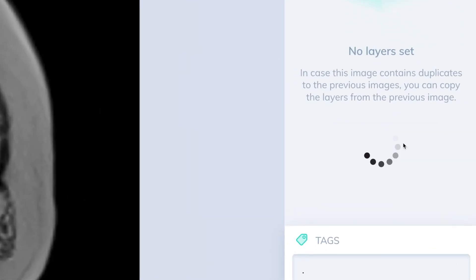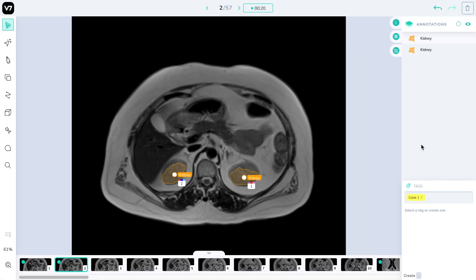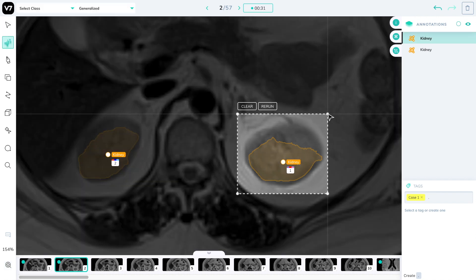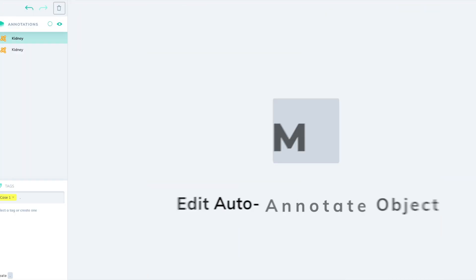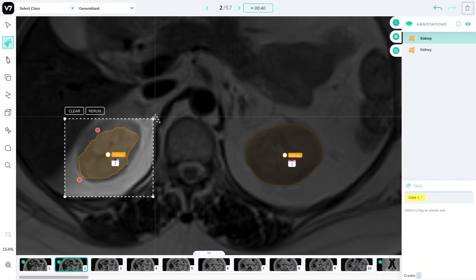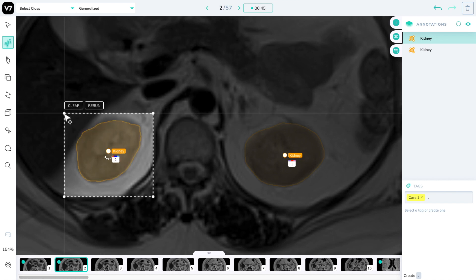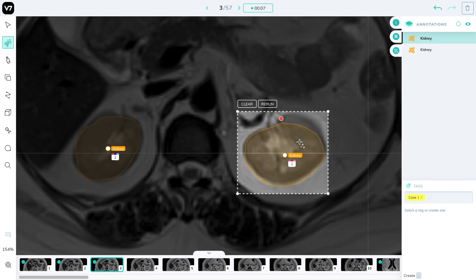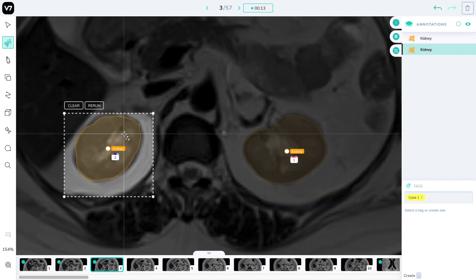Moving on to the next slice, we can use the copy instances button to copy over the previous annotations. Things have changed a little bit, so we can click the edit button to adjust the auto-annotate output and adjust its box — Darwin will adapt to it automatically. The shortcut for this is M. We'll do the same on the other kidney and clear these points to make sure we don't exclude anything. We'll move on to the next slice and repeat the same thing, making sure we're still looking at kidney number one and kidney number two.